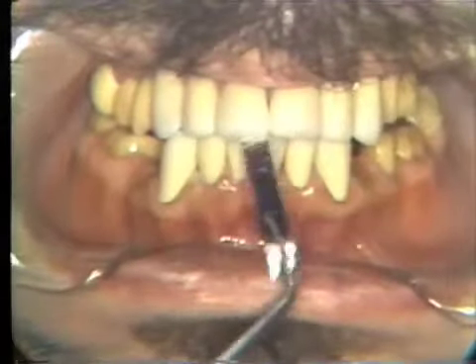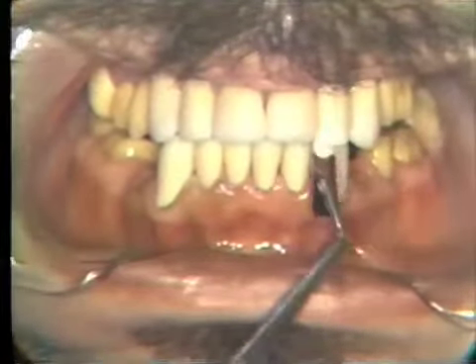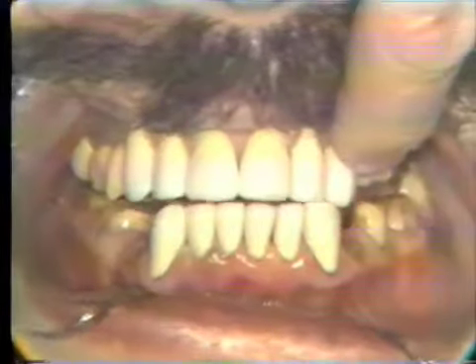Close, please. Tap, tap. Close. Just hold it. Now we just have a very light contact on the centrals and laterals. Open, please. Close. Now I want you to slide from side to side slowly. Now what we want here is a nice, even, smooth movement from side to side. So we want to recontour, close, rub from side to side. Open, please, close, side to side.